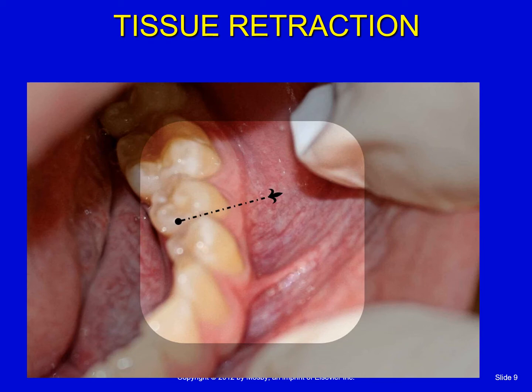It'll be about 4 millimeters or 5 millimeters away from the actual fold down by the teeth, and that's perfect because then you won't be accidentally putting your needle closer to the mandible, because it will scrape right down that bone.